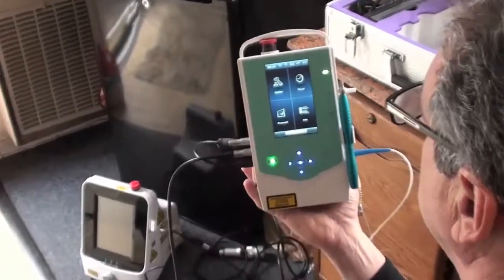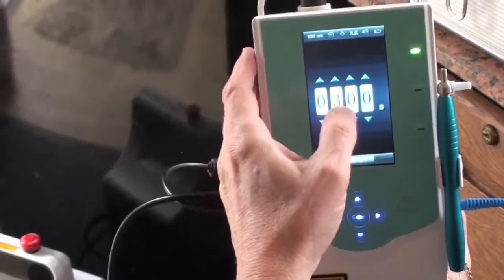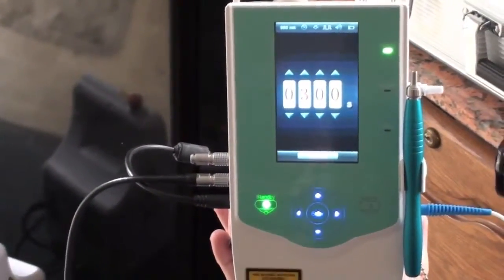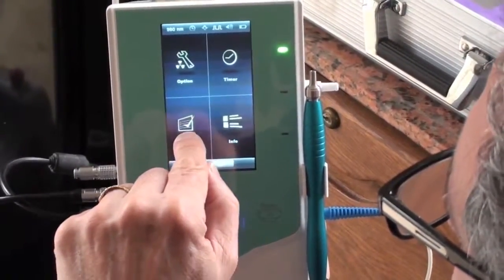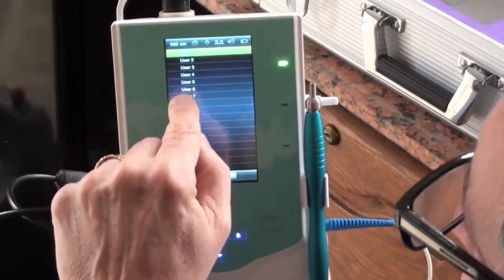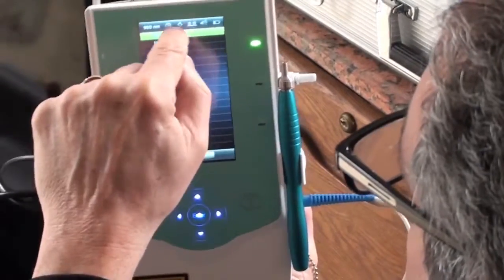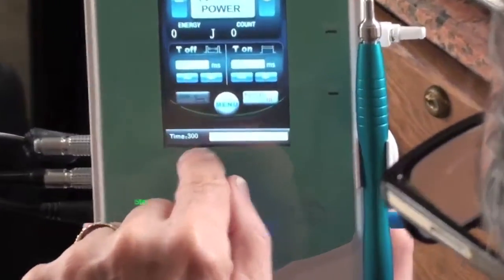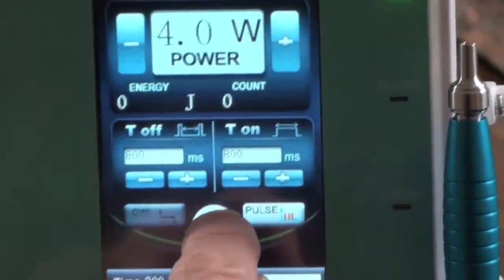Menu. We're going to put the timer. You can set it for 5 minutes because you're going to put in 500 joules on the big toe, 250 on the lesser toe. You also want to put in the protocols that you have. You can set them if you want to. There's the timer, 300. You got it in pulse, 800 milliseconds, 800 milliseconds off. You got 4 watts. Let's go to the menu.